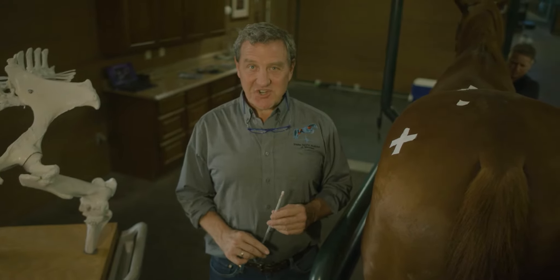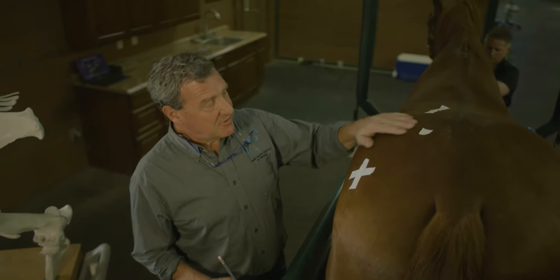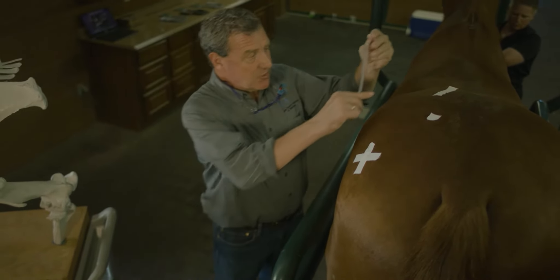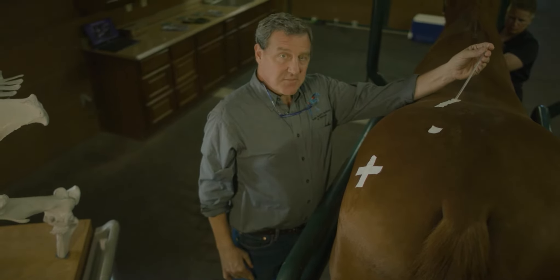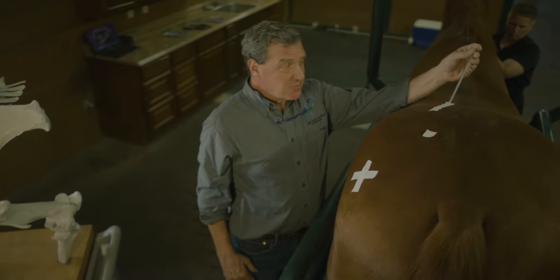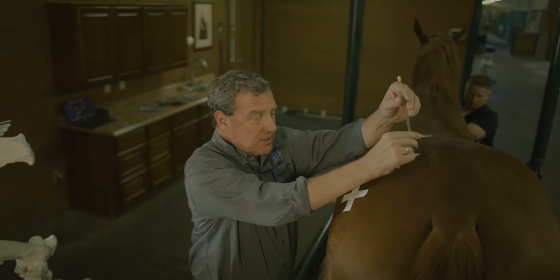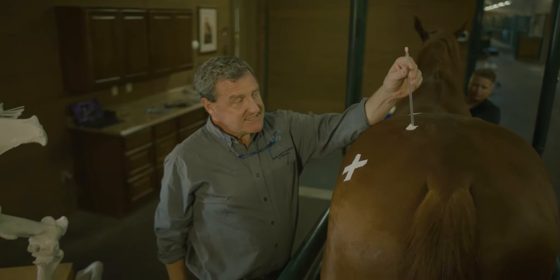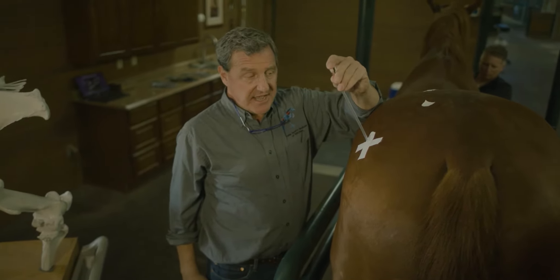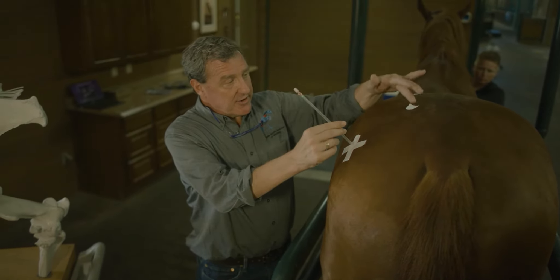I'm going to review three ultrasound guided injection points as part of our pelvic review. On our patient here you can see outlined with tape — the cranial portion is going to be for the lumbosacral intertransverse joint, and our needle would be positioned at roughly that distance from the median plane and that angle. The true sacroiliac injection point is caudally here, close to the midline. The ultrasound guided hip injection is roughly here, and after ultrasound imaging you may be shifting that, but this is roughly what it looks like on the patient.